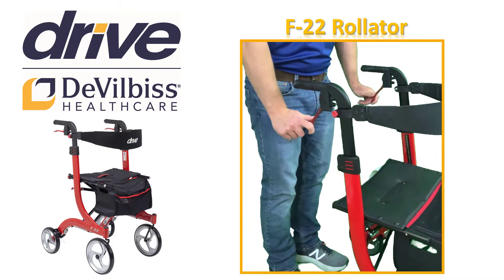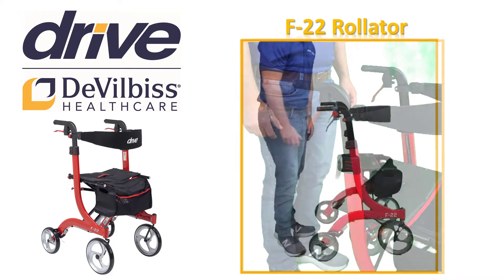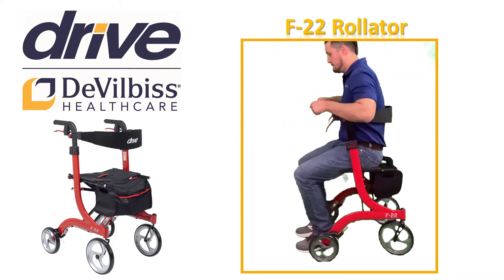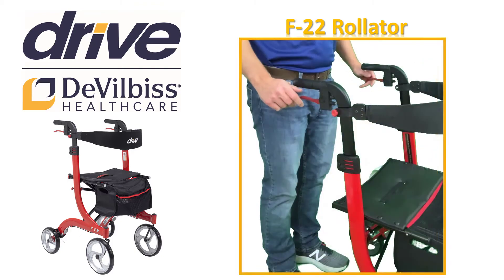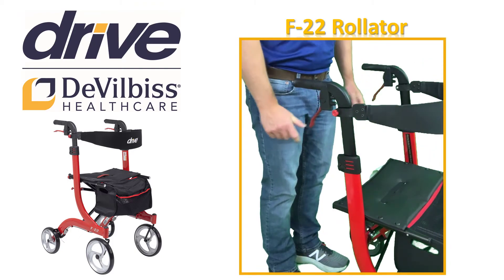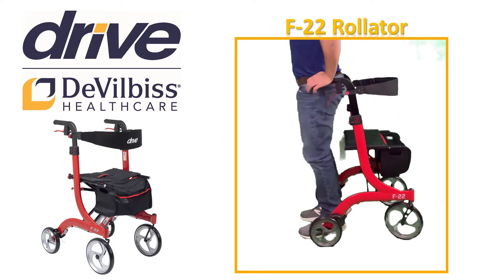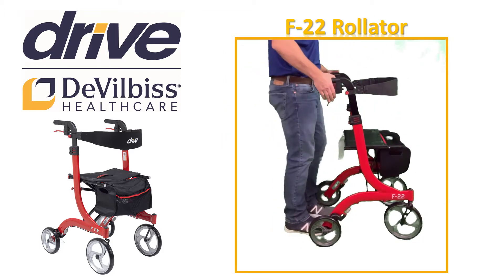Before you ever sit down, you must put the brakes in park position so the Rollator does not move while you are trying to sit down. To do this, simply push the red handle down as far as it will go. After you stand up and are ready to walk again, remove the park brake by pulling the brake lever up.